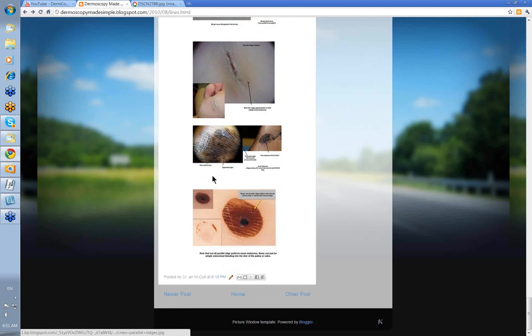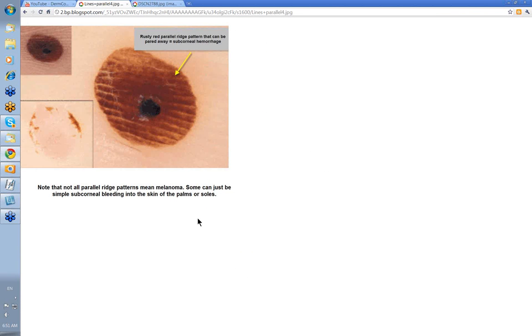Not all parallel ridge patterns are in fact melanoma. Some congenital nevi can actually give you a parallel ridge pattern. Look at this one — this is the talon noir, a bit of sub-corneal hemorrhage, and this can give a parallel ridge pattern. The easy thing: take a 15 blade and just gently trim away that corneal layer and you trim away the blood as well.